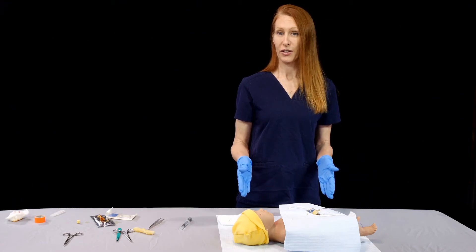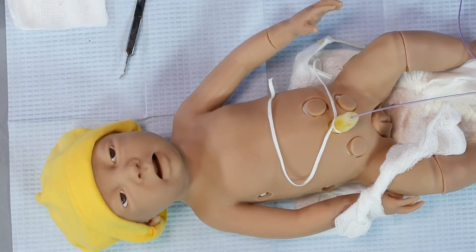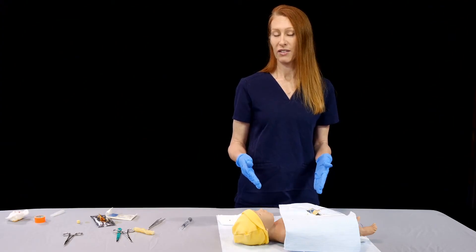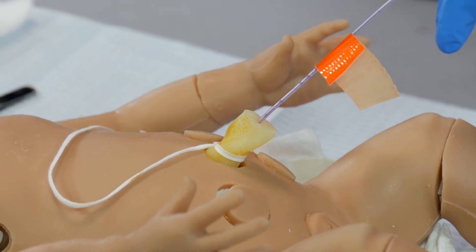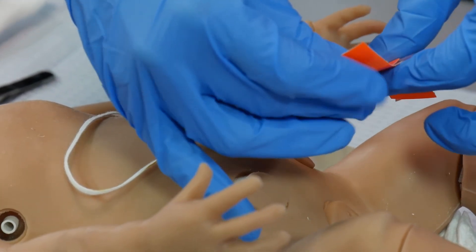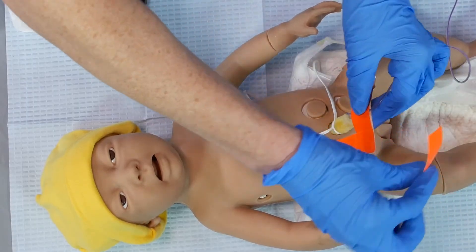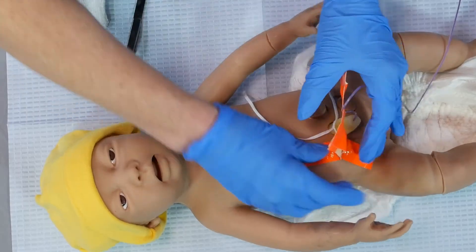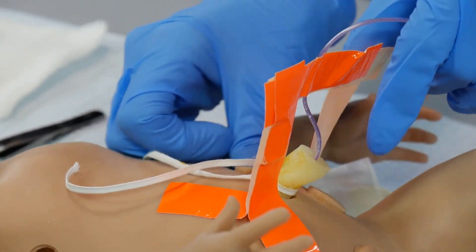Once you have the line in, the next step is to secure it. Start by tightening down on the umbilical tape, and then secure it with some additional tape. One of the well-described methods is the H-type method, where you make a little line of tape across the umbilical line and tape it to the baby's abdomen. I'm going to put two pieces of tape across the line, which will be secured between the two pieces of tape, and then on either side use additional tape to fix this to the child's abdomen — giving the line enough laxity that the tape doesn't pull it out, but maintaining it so providers don't easily dislodge the line.